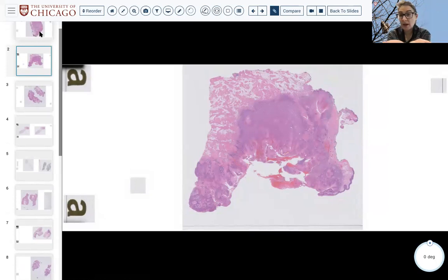Maybe on gross they looked exactly the same, and it was just on the histology where they became slightly farther and slightly nearer. But the tumor was obvious grossly. They selected a very appropriate specimen to freeze. Saying that it was 1 millimeter or less would have resulted in the same outcome as saying that it's positive.